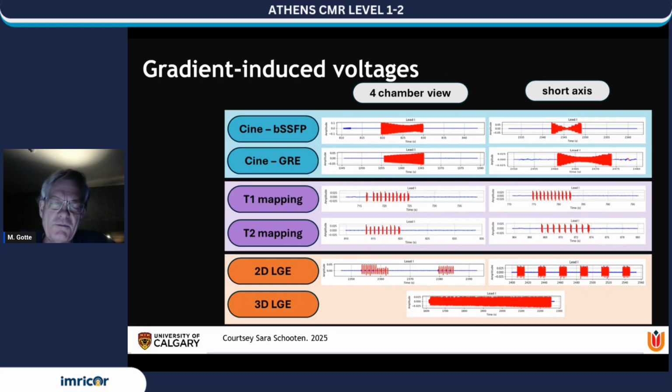Other strategies, I touched upon this a little bit in my previous talk, is that you scan to track, for instance, devices, but the North Star system also allows you to start to scan in bursts, so a kind of interrupted scanning. And then we only apply the tracking sequence to identify the position of the catheters in the heart. But there are short periods that there is no scanning performed, and within these periods you can also see a better quality EKG. Combined with this strategy, it is, in our opinion, acceptable for clinical applications.